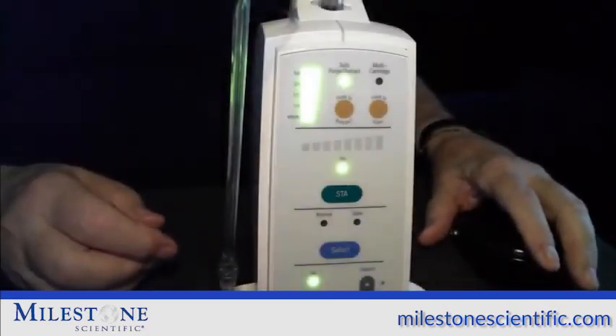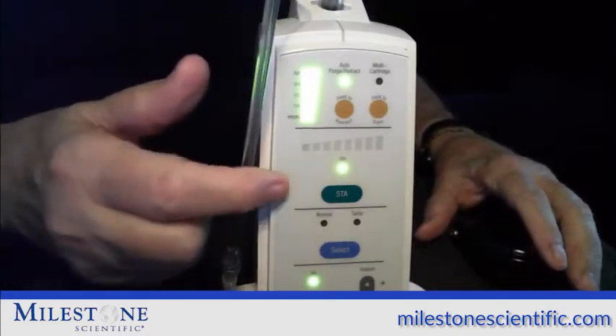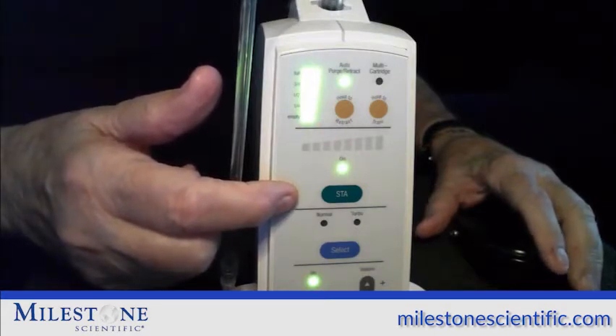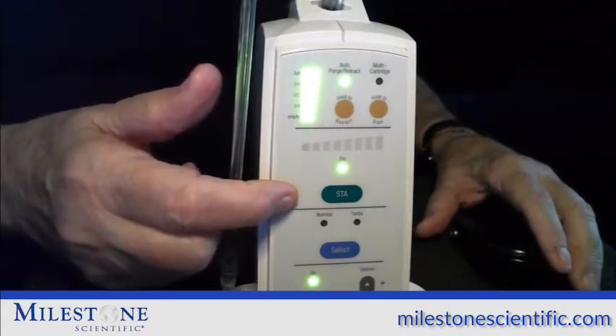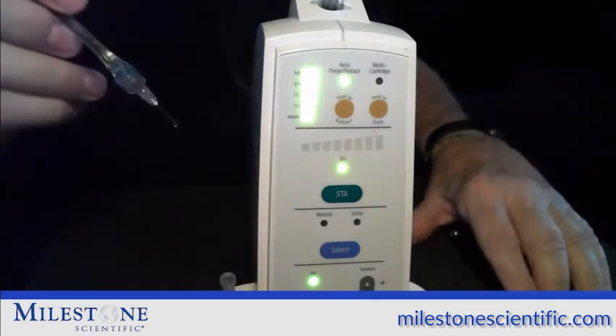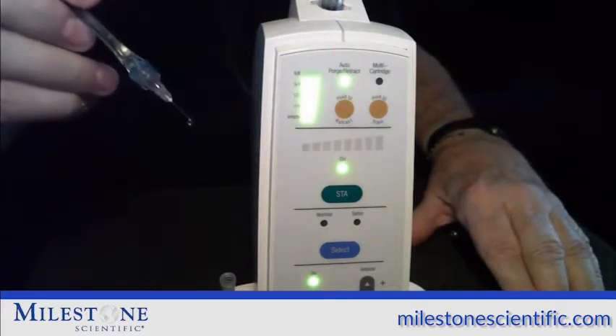When performing all of the WAND STA injections, make sure that the instrument is turned to the STA mode. This will produce a flow of anesthetic of one drop every two seconds, which is below the patient's pain threshold. In order to initiate the flow of anesthetic, hold the foot pedal down until the voice says cruise.